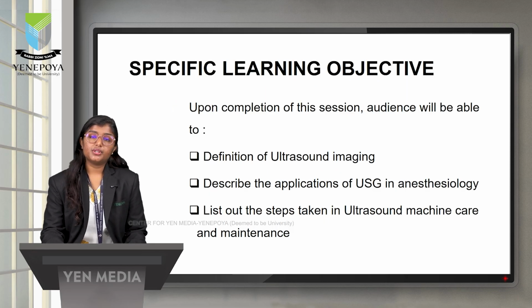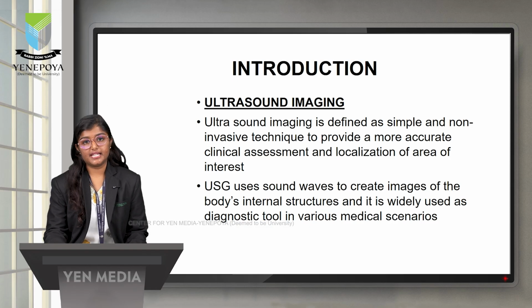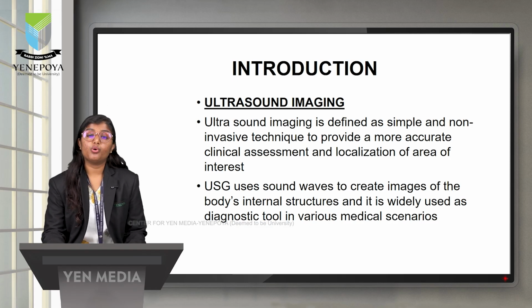Upon completion of the session, the audience will be able to know about the application of the USG in anesthesiology, the definition of ultrasound imaging, and list out the steps taken in ultrasound machine care and maintenance. Starting with the introduction, ultrasound imaging is defined as a simple and non-invasive technique to provide more accurate clinical assessment and localization of the area of interest.